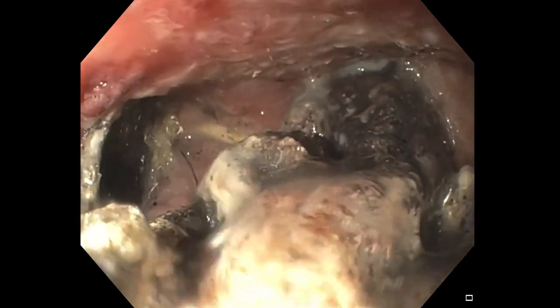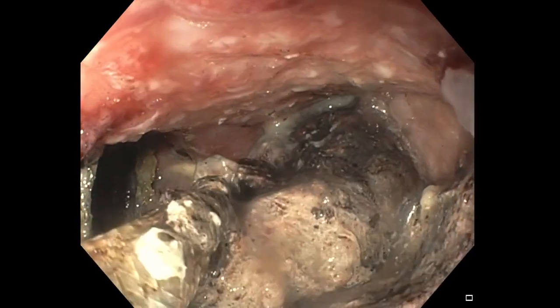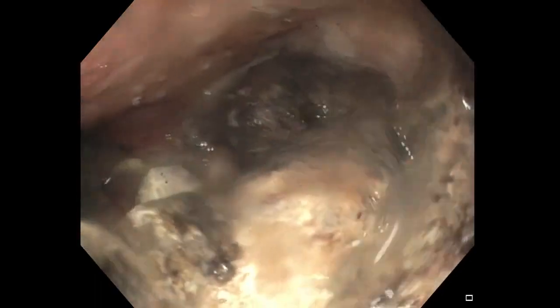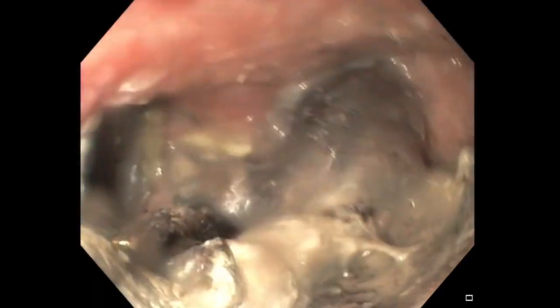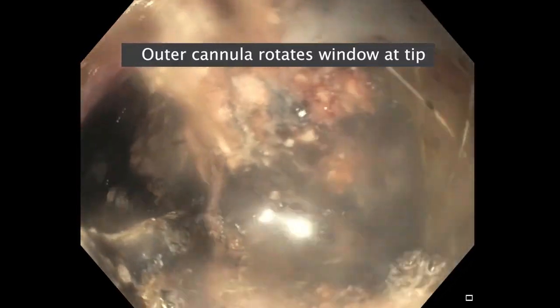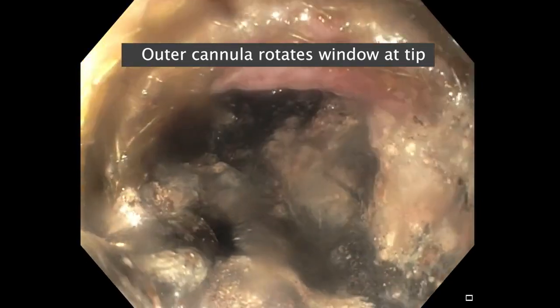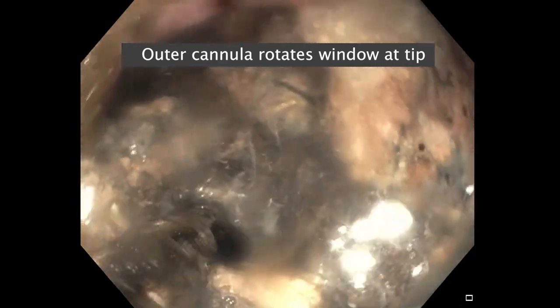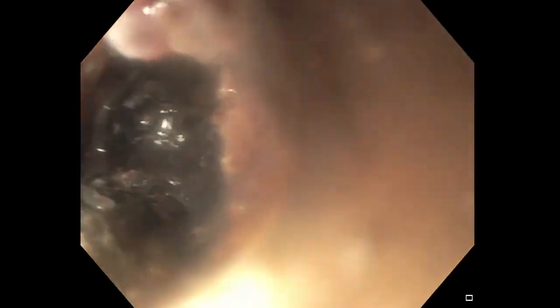We try to keep the tip at the edge of the necrosis, essentially working the tip like a wood chipper. So we are gently swinging back and forth, writing the edge of the necrosis. Here you can see nicely illustrated how rotating the outer cannula rotates the window at the tip.